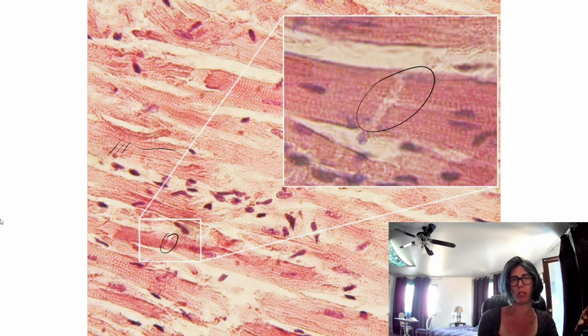This is why it's good to look at a lot of images. You have to gain an intuition for how these look under a microscope. And look at all different parts of the slide. Here the striations are really clear. Right? You can really see them in some parts of the slide. They're kind of harder to see in others. And that's heart histology, cardiac histology.